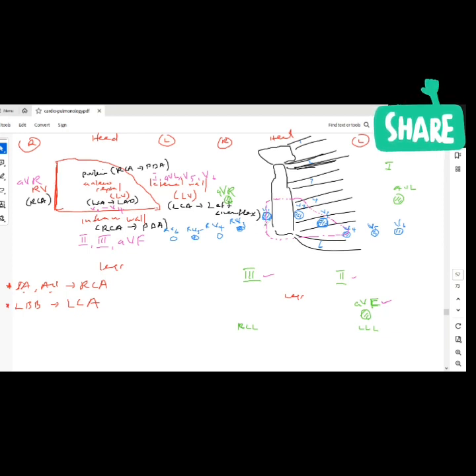Now let's take a step. We know the lead, location and artery. What will I see? What am I looking for on ECG to tell me that the patient is having an infarction or ischemic changes? So let's go to the next.